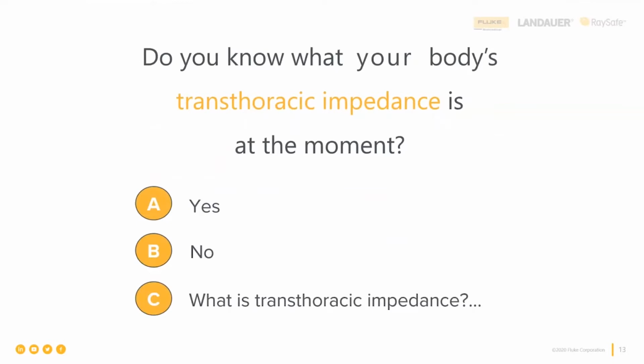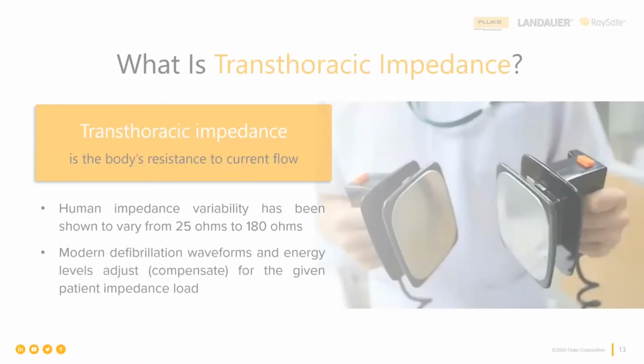And so I see a few answers coming in. A few no's. Some of you guys actually know what it is. The 50, 60 ohm, 30 ohm. Good, 100 ohm, we'll talk about that. No, I did not. Well, Kevin is saying it varies, but the nominal testing load is 50 ohm. That's an interesting answer, and that's exactly what we'll be covering today. Yeah, most of the answers are no, or option B. Okay, good. Well, let's move on and let's see more information.